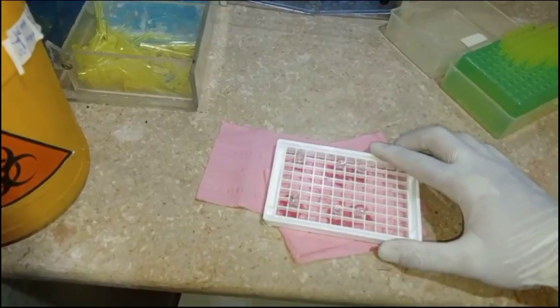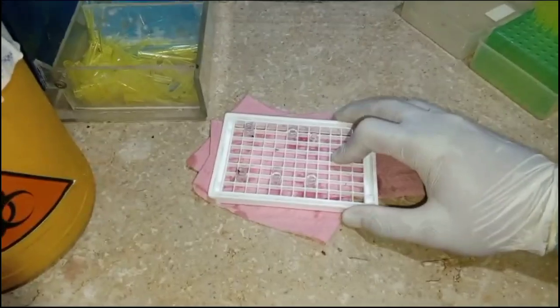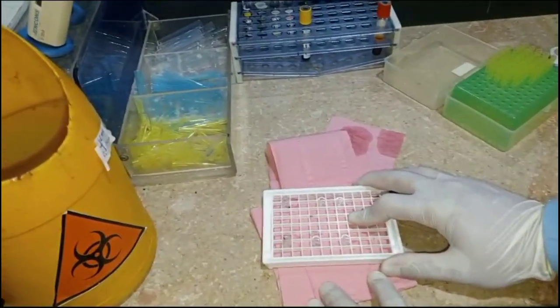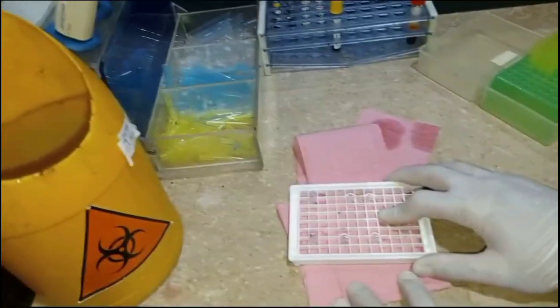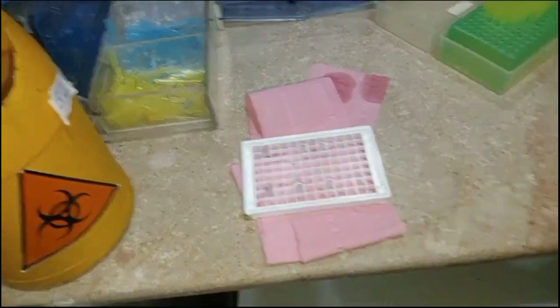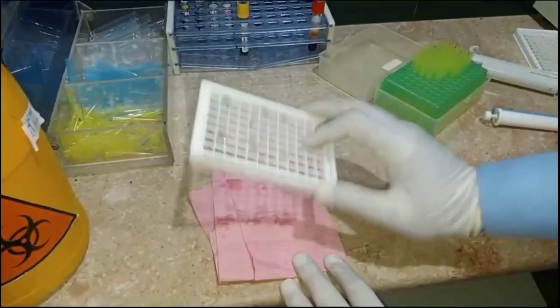Now after that we should dry each well. These are the wells, and we have to dry them. We will place the tissue paper and then invert the ELISA plate, as you can see. So what will happen, the wells will be dry.